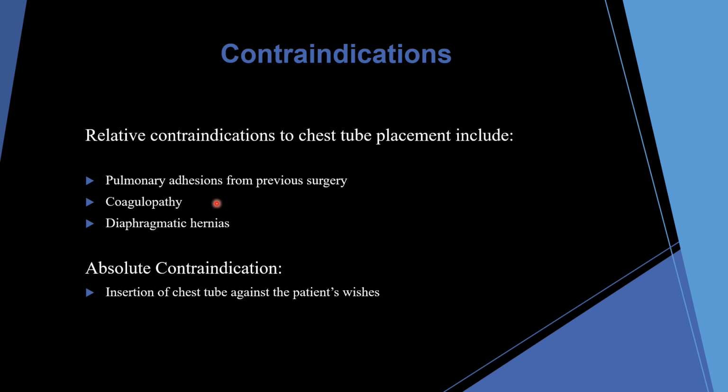But if you have a coagulopathy problem, you have low platelets or something, or your INR is too elevated, you can expect the physician to order something like FFP or platelets prior to the insertion, or be infusing them as they place the chest tube, and this will decrease the risk of bleeding from the chest tube placement. Another thing the doctors need to consider is anybody with abdominal hernias, those great big huge hiatal hernias pushing up on there. That tissue is already compromised. They go in and put that in, they can clip that and they can puncture the diaphragm.